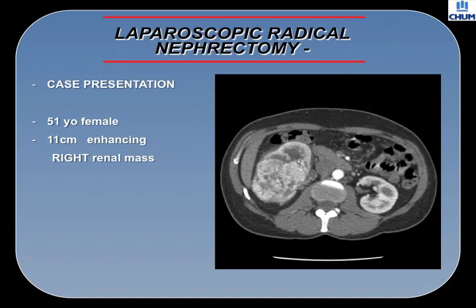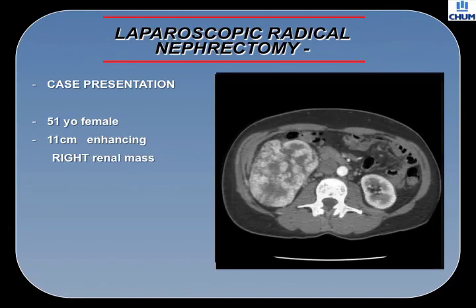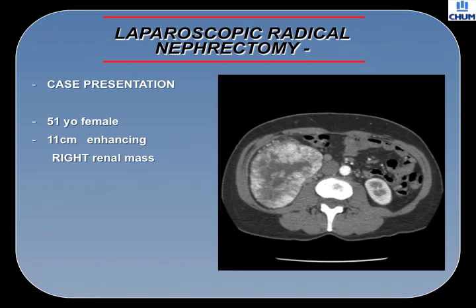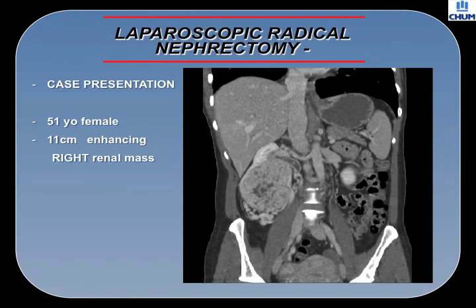Indications for the surgery usually entail a very large mass that is not amenable to a partial nephrectomy. The following case presentation is of a 51-year-old female with an 11 cm renal mass, which enhances as can be seen on the CT. On the left side of the screen is her right kidney and on the opposite side is her normal contralateral kidney. Note the size difference and the color discrepancy. The central aspect of the tumor is very heterogeneous and shows central necrosis. It is for this reason that the gold standard treatment is a radical nephrectomy. This can either be done through an open approach or through a laparoscopic approach. Surgeon experience and the level of extension of the disease makes the decision between those two. Also note the large parasitic vessels around this tumor, which make its dissection particularly difficult.